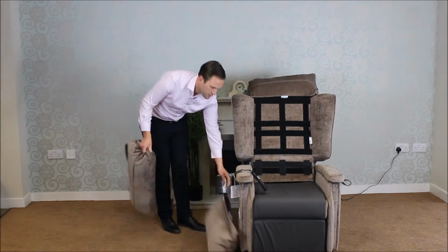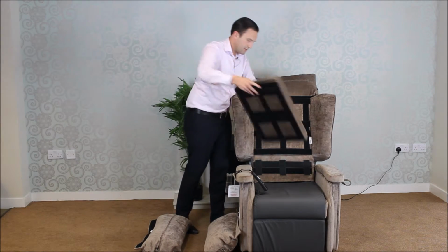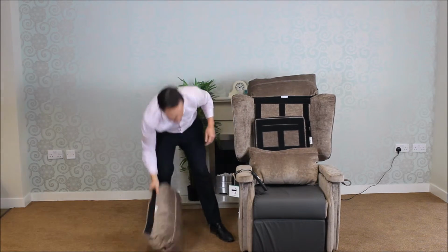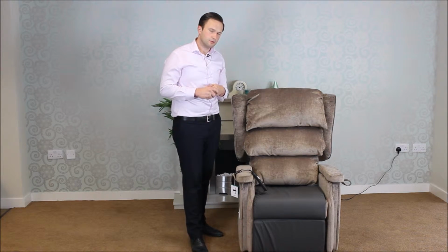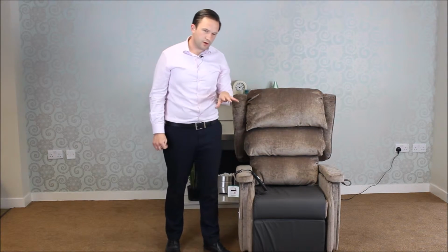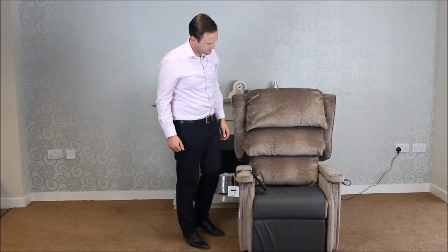Remove the cushion, the pillows from the backrest, and then fit a depth adjustment kit and just replace the pillows. So as you can see, this simply reduces the depth of the chair by 2 inches. This can help the user to be more comfortable, especially if the depth is too great in the first place. Also check the seat height. If it's too low, the user may be finding it difficult to transfer off. If it's too high, the feet might be hanging, and again could cause comfort issues.